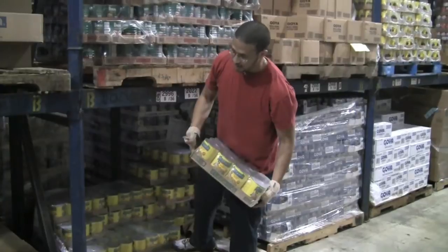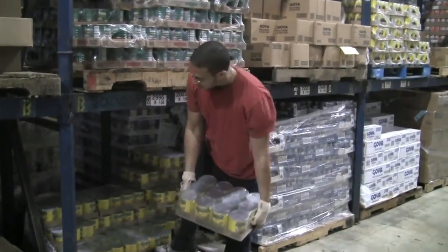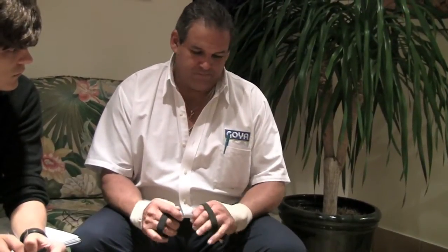The warehouse manager informed us that he found the Hold extremely helpful and would be willing to consider purchasing the device for employees. Just like the brace, at the beginning you don't want to use it, but then you realize that it helps you. And this is something that will help.